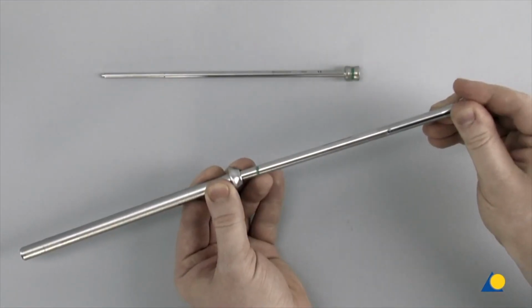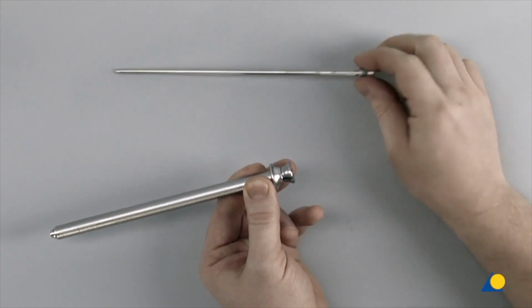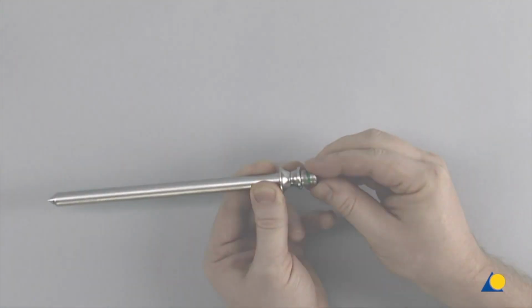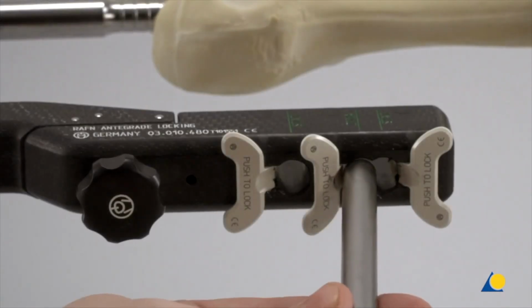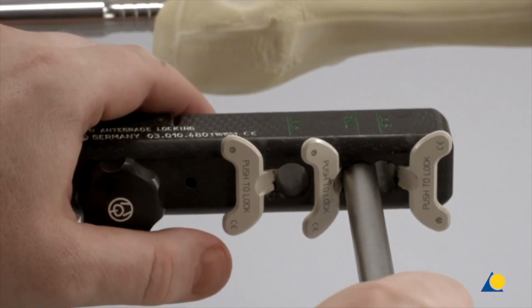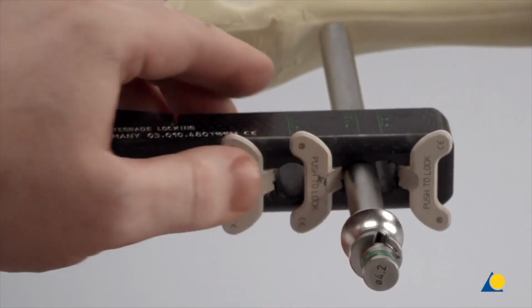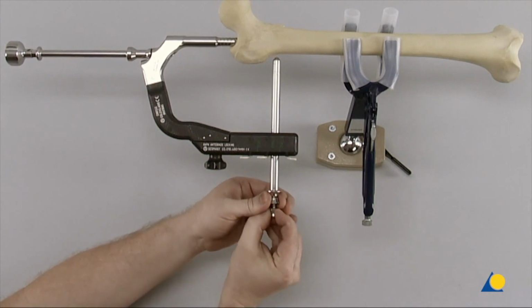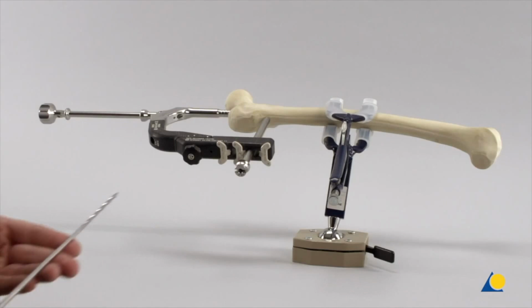The green color-coded triple trocar is assembled by inserting the drill sleeve into the protection sleeve, followed by the trocar. The green color-coded three-part trocar assembly is inserted through the caudal lateromedial hole in the aiming arm to the bone, and the camlock lever is closed. The trocar is removed, and the calibrated 4.2 mm drill bit is used to drill through both cortices.